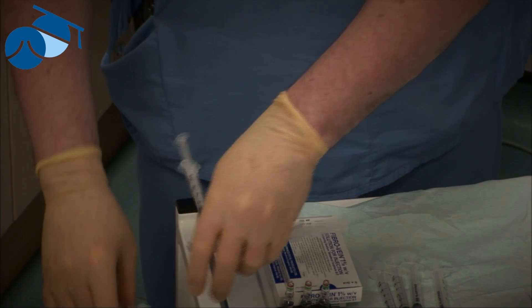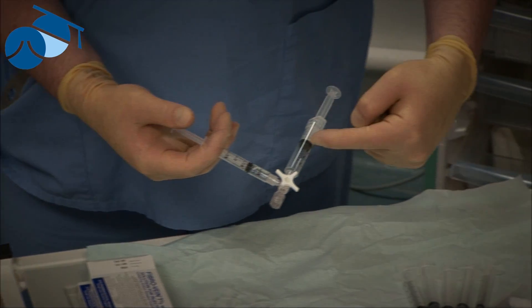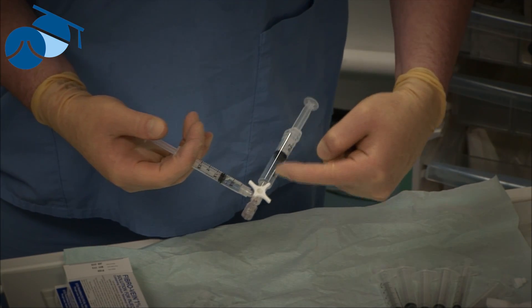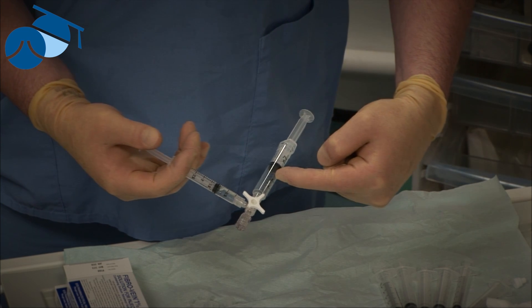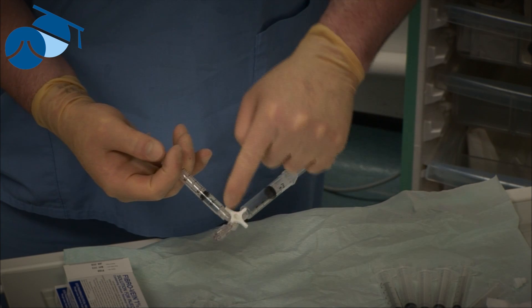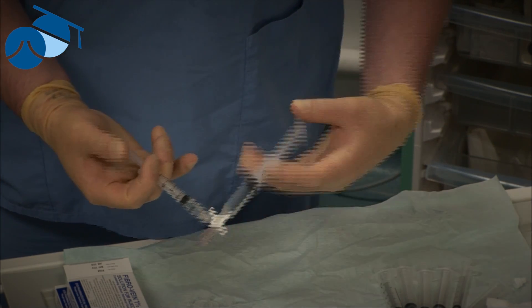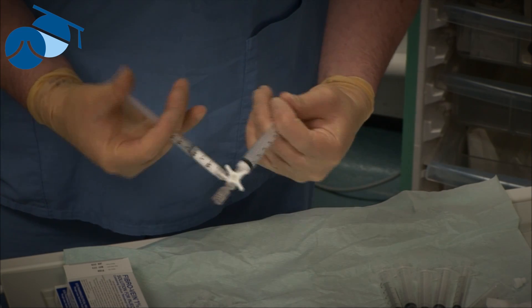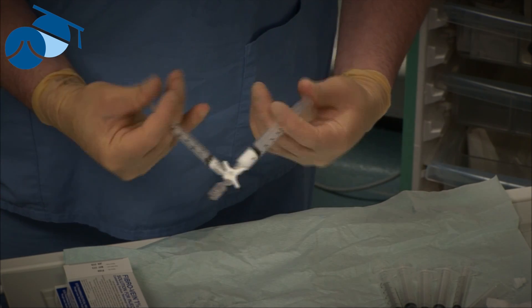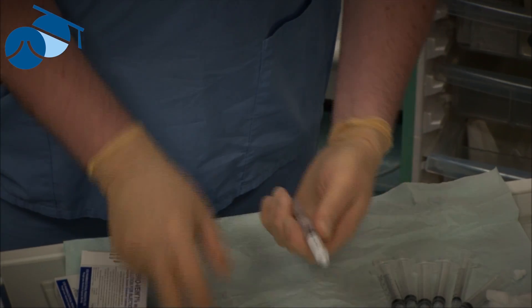We switch the gas off and also switch it off at the tap so we can separate the Tessari syringes. At this point we have no air in the system — just carbon dioxide and oxygen — four parts gas to one part sclerosant. We don't set the three-way tap at a right angle but slightly off to increase the turbulence, then do approximately 10 passes to make the foam, ending up in the larger syringe. And there's our foam.